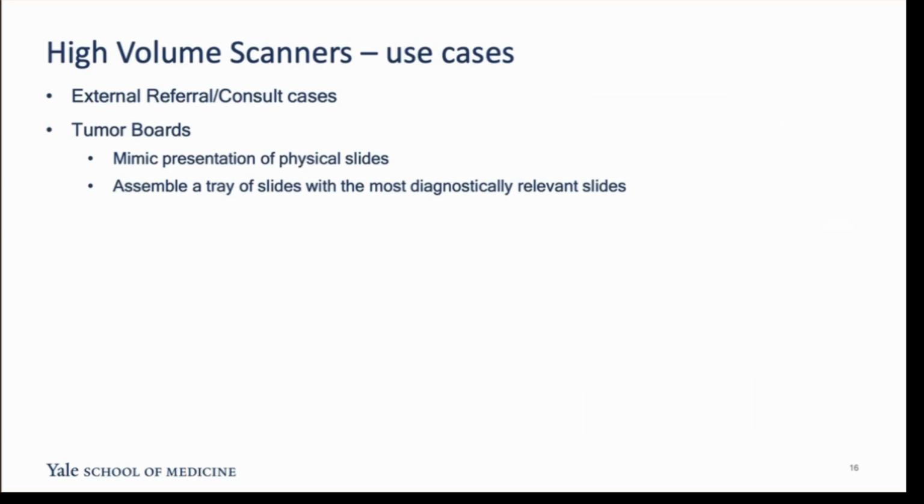The next thing we turned our attention to was tumor boards. Post-COVID, we do virtual tumor boards on Zoom. Typically, a list of patients is circulated prior to the tumor board. We pull the slides, and the presenting fellow or the attending goes through the cases and picks the most diagnostically relevant slides. On the day of the tumor board, they present to Zoom using a microscope hooked to a camera. What we wanted to do was mimic that workflow digitally.